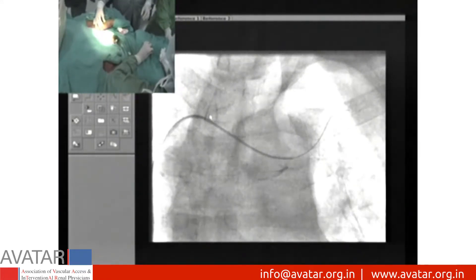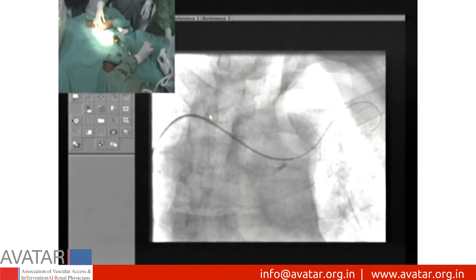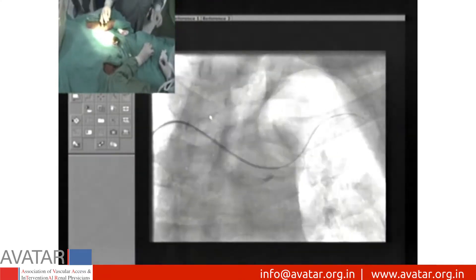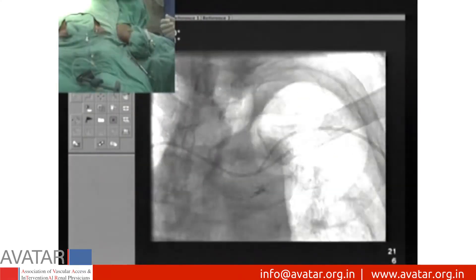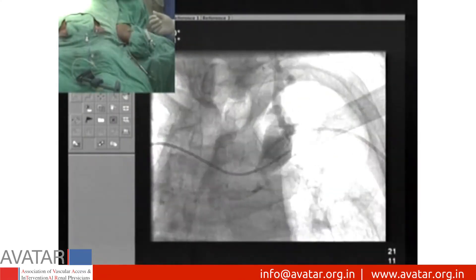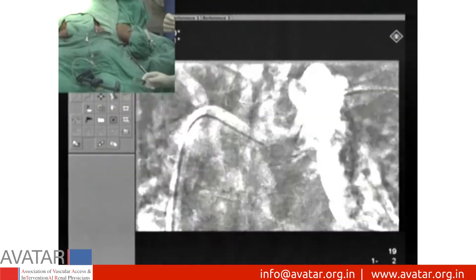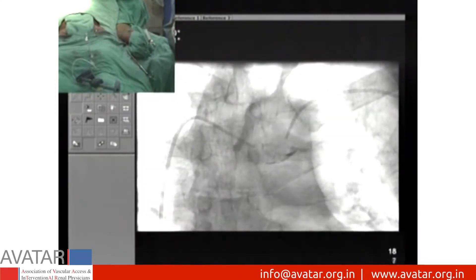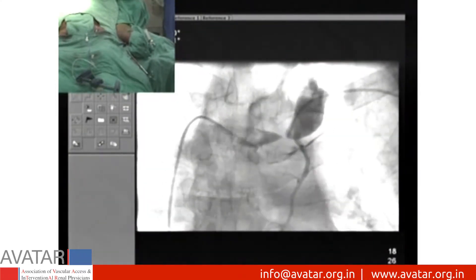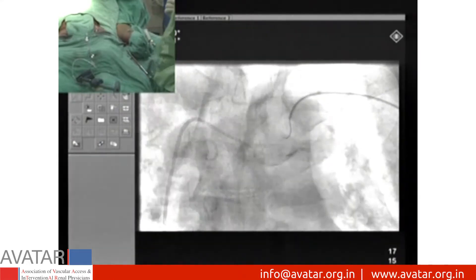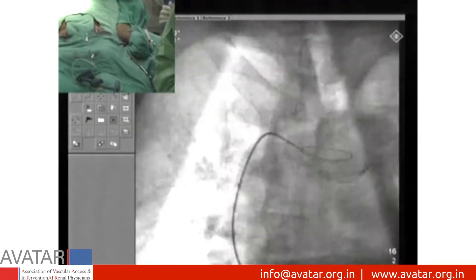Since we were still facing difficulty in negotiating the stenosis, contrast is instilled from both punctures — femoral and the AV fistula side — and with the help of roadmap, the plane of the wire is repositioned.